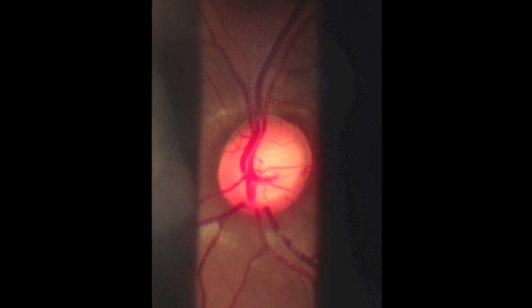To view the nasal or temporal retina, ask the patient to look in the direction of the part of the retina you are trying to view. You should rotate the microscope and the illumination system in the opposite direction to this. Reflections can be reduced slightly by tilting the lens or by putting the illumination slightly out of click.